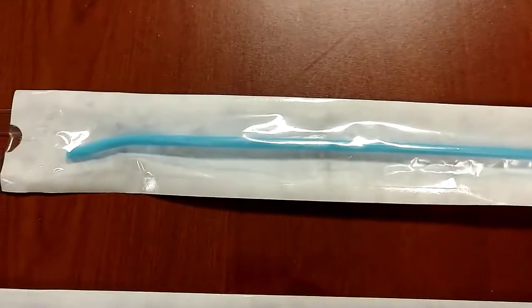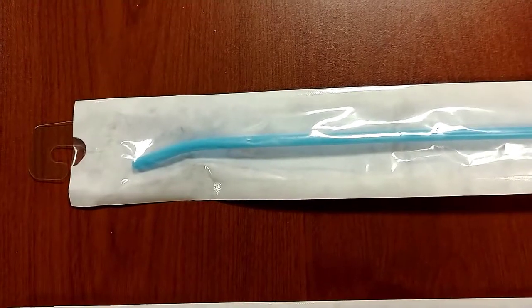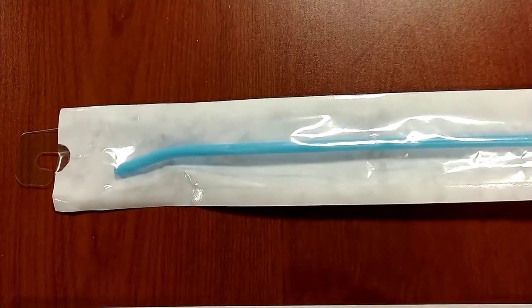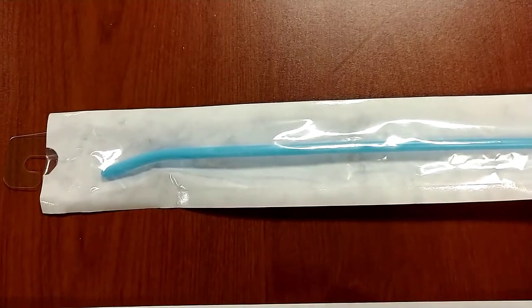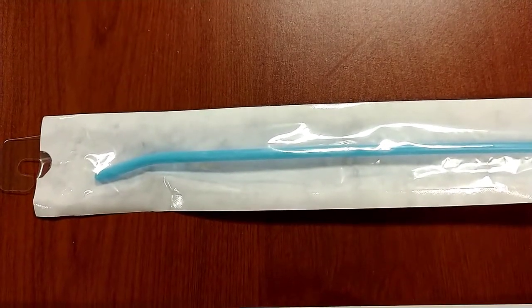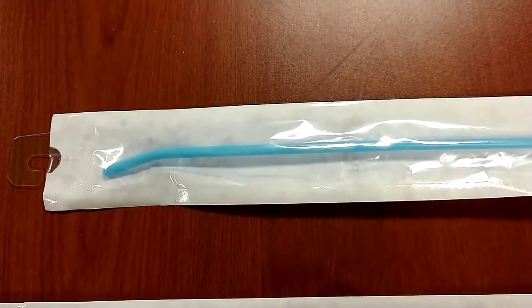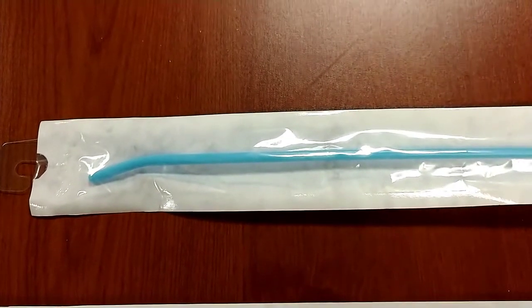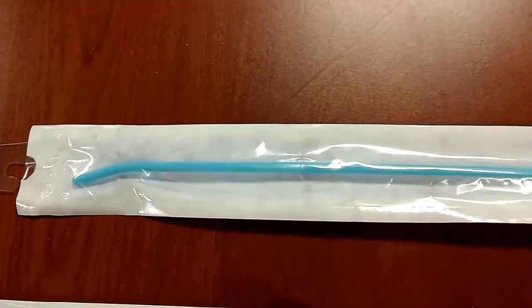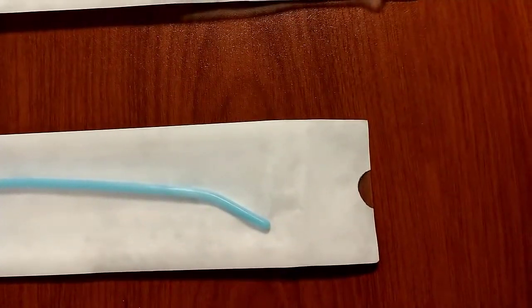As you will also see as I turn them over, the tip of each one, this happens to be the adult, has a coude tip on it, which is slightly angled, and that angle always points to the anterior part of the patient. As you go through the vocal cords, you should be able to feel the tracheal rings on adults and older children. And then here you can see the same tip on the pediatric.